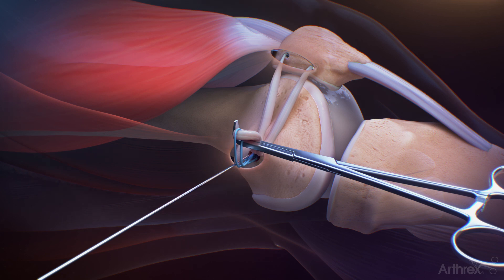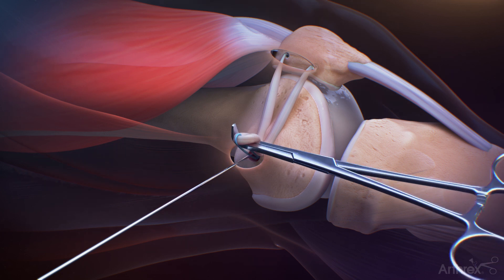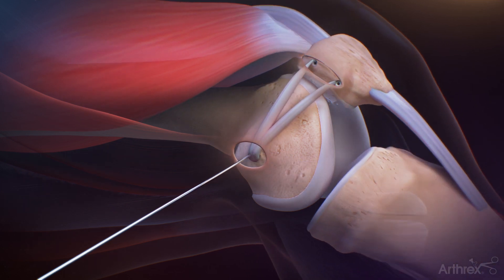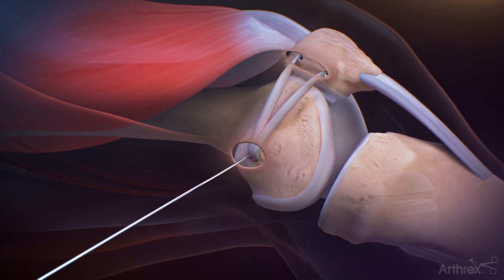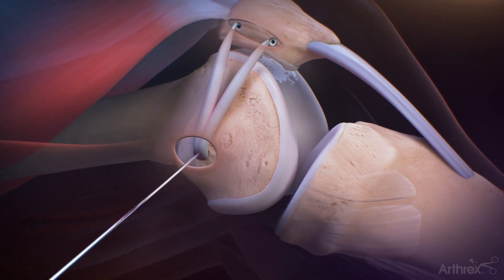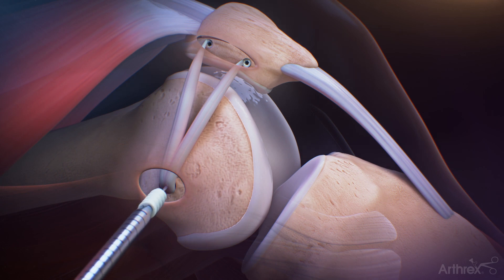Using a clamp as a pulley, pre-tension the graft and insert it into the socket with equal tension on both graft bundles. Once the proper isometry of the construct has been confirmed, final fixation can be accomplished. While maintaining tension on the graft, insert the 6 mm by 20 mm biocomposite fast thread interference screw into the femur.